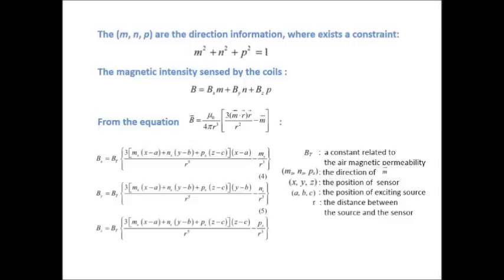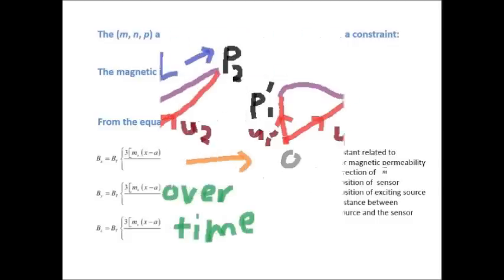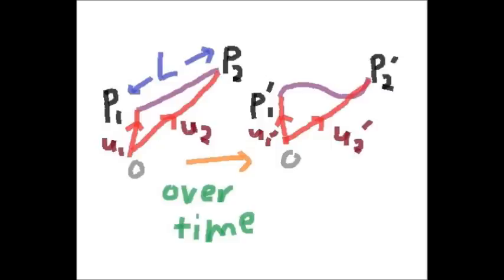But as the equation is nonlinear, analytic results are not achievable, so we can only get an optimum solution through numerical methods. Therefore, the more equations there are, the better the result is. The magnetic field components x, y, and z, which were described earlier for each point on the endoscope, are then detected by the sensors, and from the equations the positions are solved numerically and used in curve fitting.